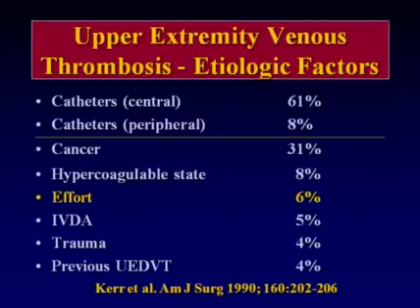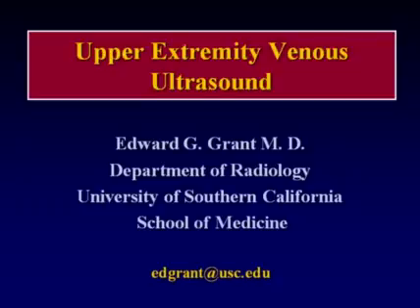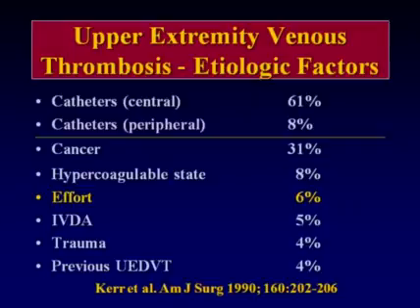When I think in terms of venous disease in general, I think it's worth pointing out that there are definite differences between several of the problems that we encounter with upper extremity venous disease that are not the same as those encountered with the probably better known venous disease of the legs. The vast majority of upper extremity venous disease has its origin from catheters, and for this reason probably explains why there seems to be such an increasing prevalence of upper extremity venous thrombosis and associated complications, given the fact that in most hospitals the majority of patients will have some form of either central or peripheral lines.